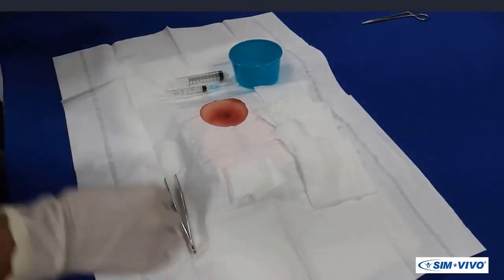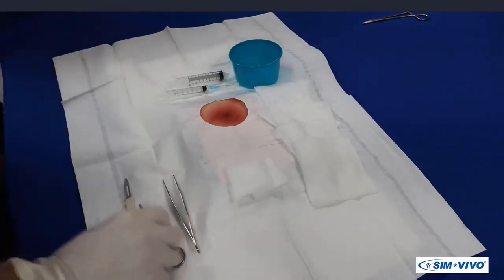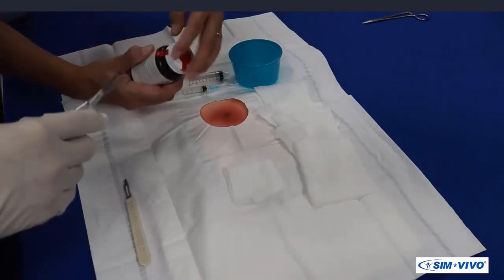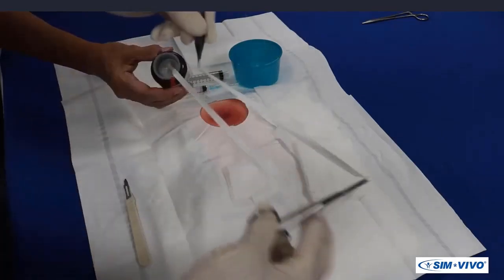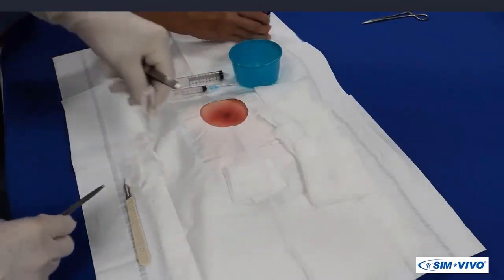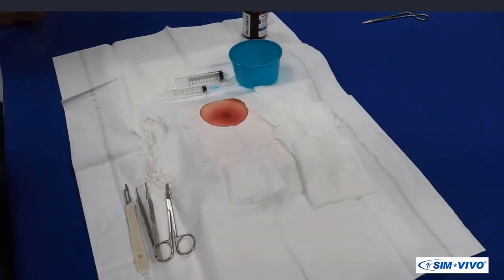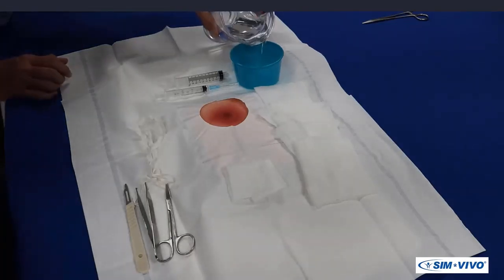The assistant should also provide Adson forceps, iris scissors, and a scalpel. After removing the cap from the packing strip container, your assistant will present you with the end — grasp this with the forceps and pull about 12 inches onto the sterile field. The assistant will recap the bottle and then pour some irrigation fluid into the procedure bowl. In the clinical situation, this will be sterile saline.